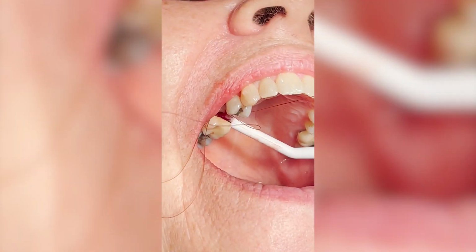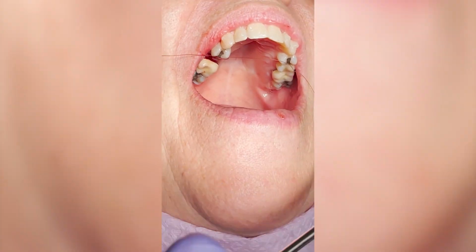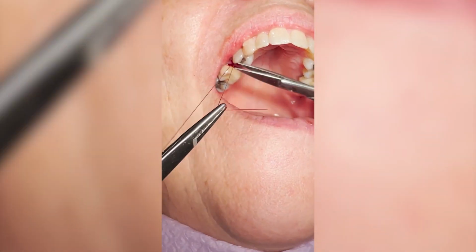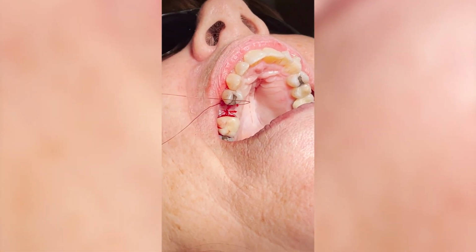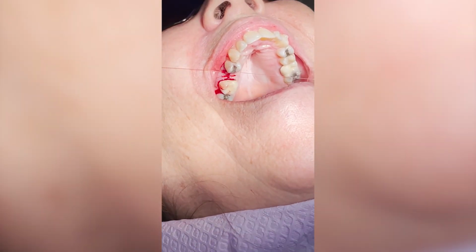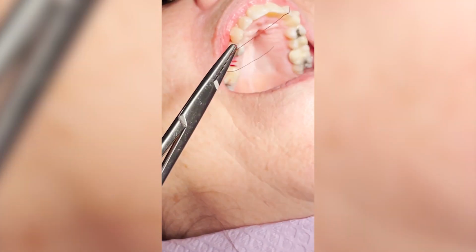When David Wong was here, man, he takes his time suturing this, making sure to put as many sutures as he needs to. I guess that's the difference between going from good to great. That guy's a beast, and he gets really great outcomes. So when you're grafting and stuff like that, definitely pay more attention to suturing.